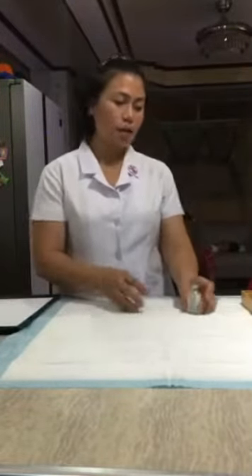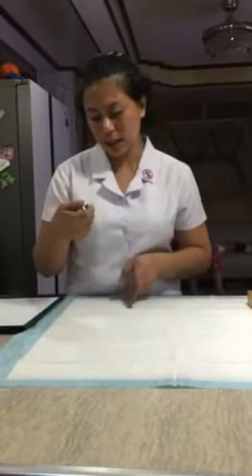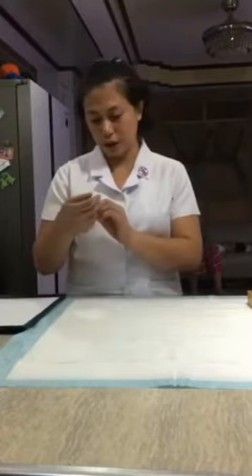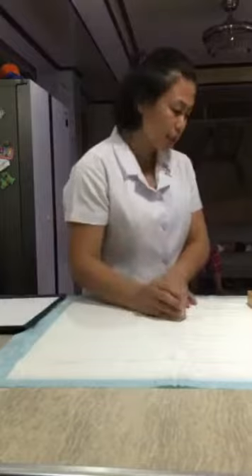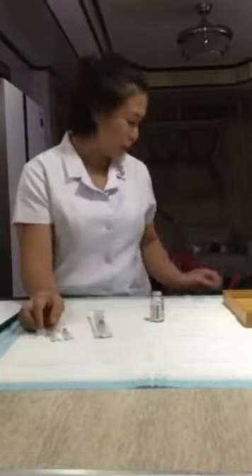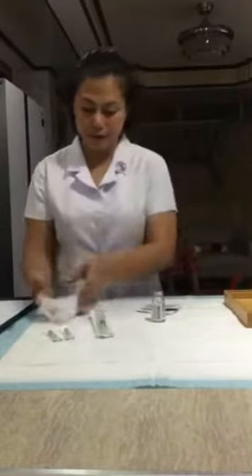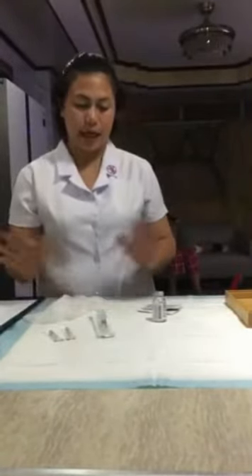So let's organize equipment. Here's the medication. In dealing with the medication, we need to check the expiration date, the lot number, and the manufacturer date. So it's been checked. We have the syringe, this is the extra needle that we needed, alcohol swab, and the clean gloves, and everything is ready. The organization of the equipment will facilitate accurate skill performance.